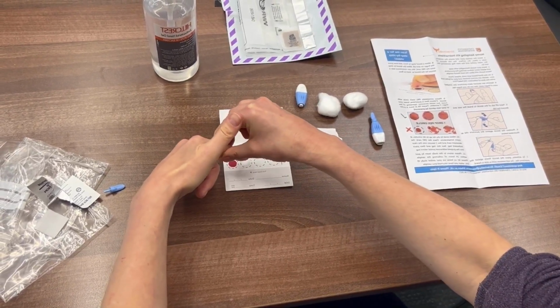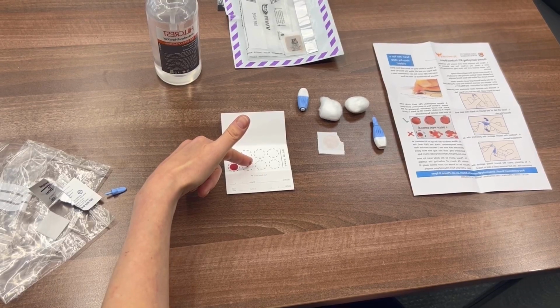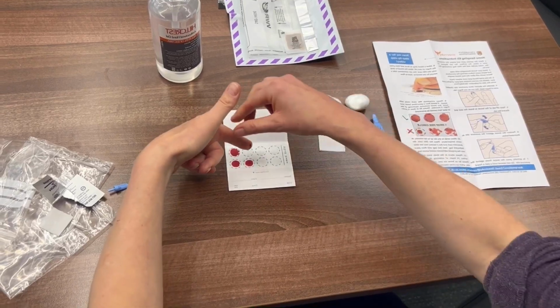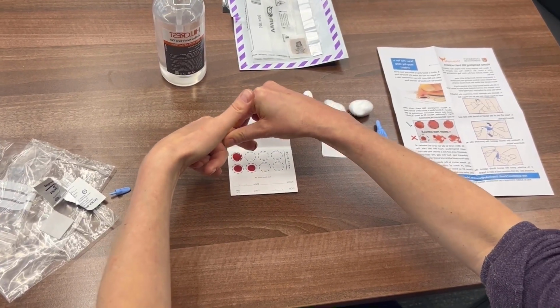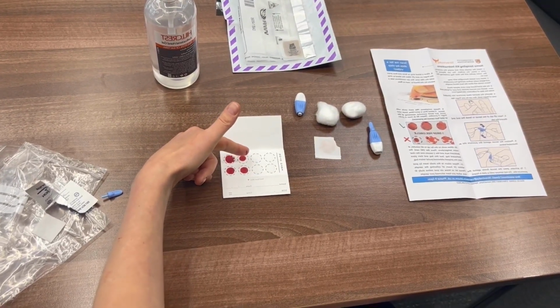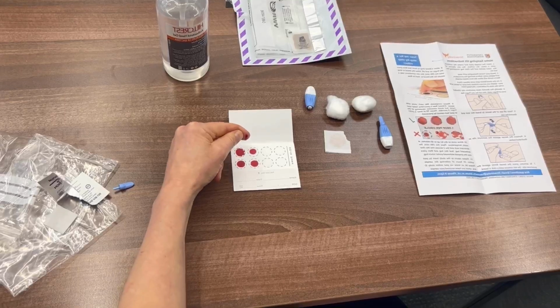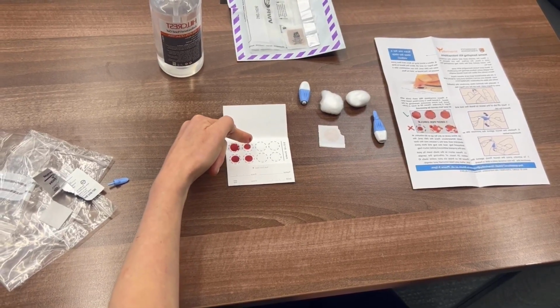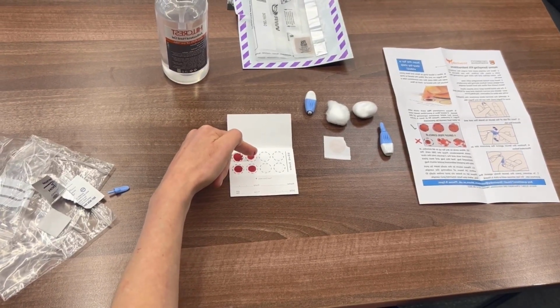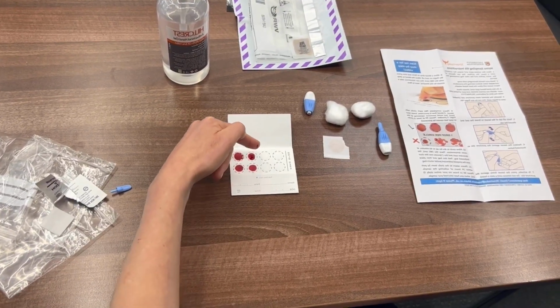So just massaging that down. I don't squeeze the tip of the finger too tight because that can disrupt the blood flow as well. Now, sometimes what happens is that you don't get a good amount of blood. And if you don't get a good amount of blood and it dries up from your finger prick, it's worth just using the cotton wool, making sure there's no more blood flow, and trying a different finger, potentially after going to wash your hands in some warm water to try and improve that blood flow.